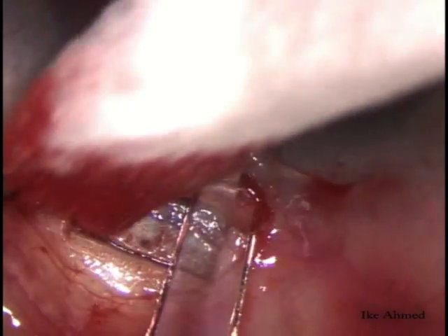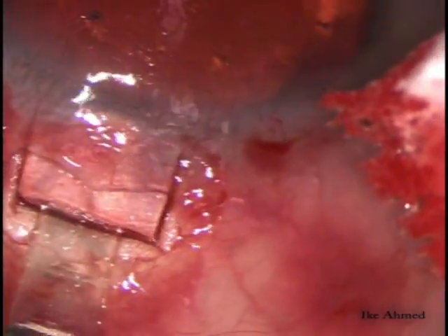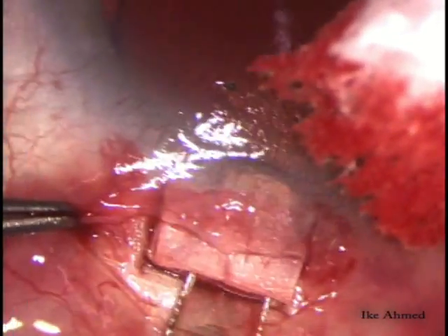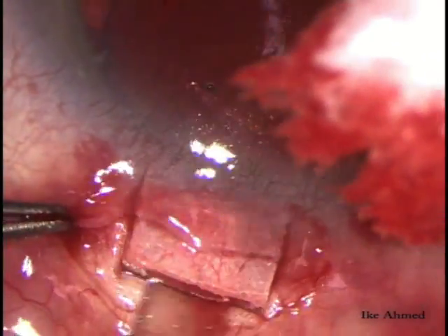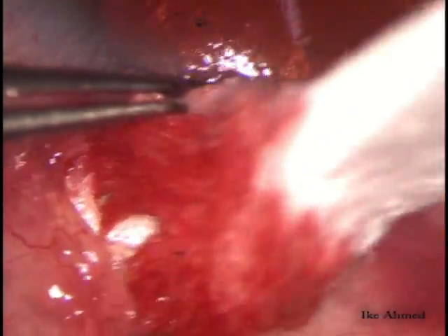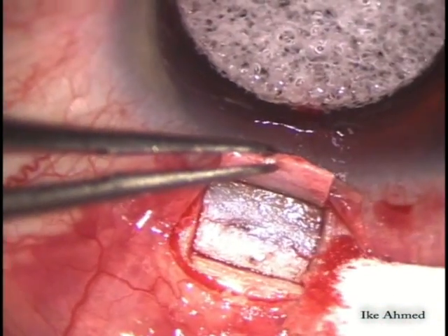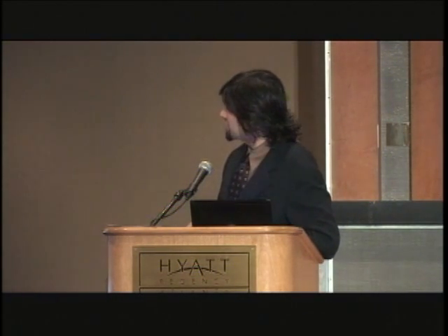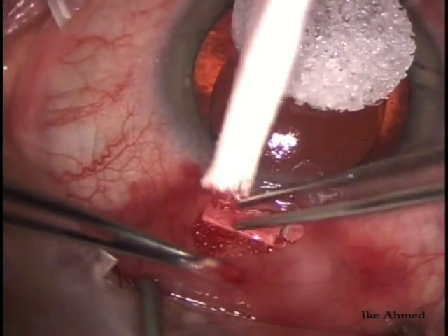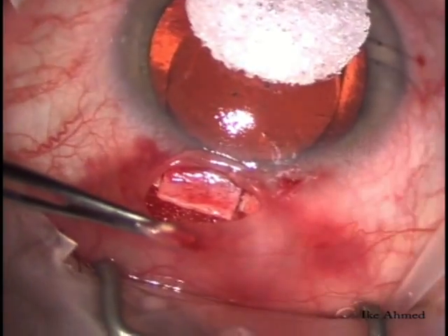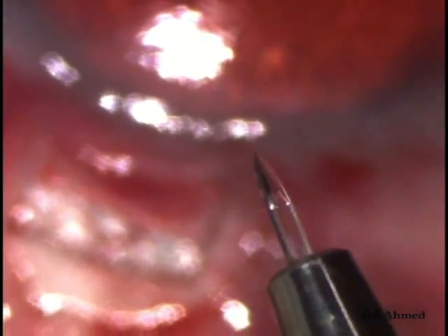Your blade of choice is a preference — metal blades, diamond blades, or tunneling techniques may be used. It's important to ensure good thickness; about half thickness is what I usually advocate, as being careless can thin out the flap. Dissecting forward into clear cornea is the goal. The blade has gone just into the clear cornea blue zone, which helps visualize and ensures we're not compressing down on the flap. The scleral spur is visible as a very obvious glistening band. Mitomycin C can be applied — my indications are as per trabeculectomy — typically applied after scleral dissection, under the conjunctiva and ideally slightly under the scleral flap as well, for a certain duration, then irrigated.